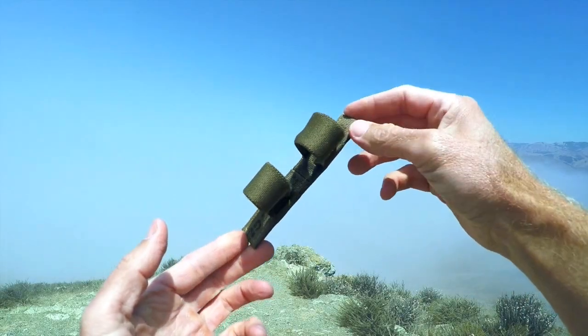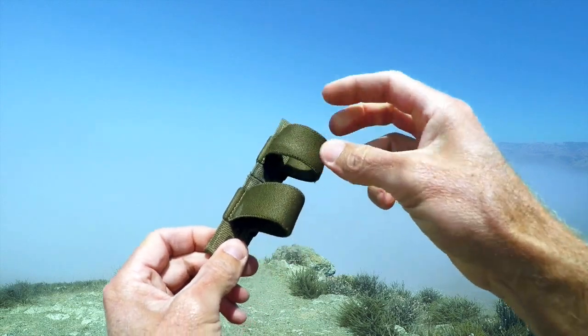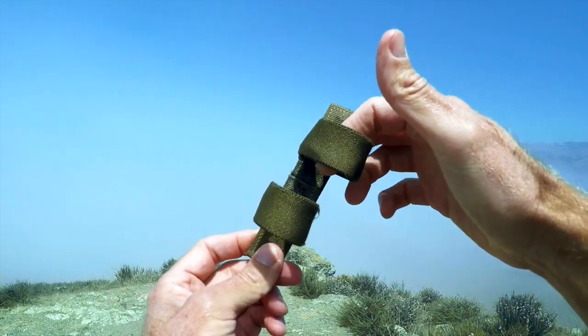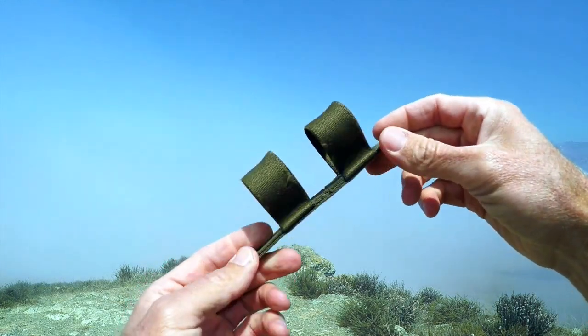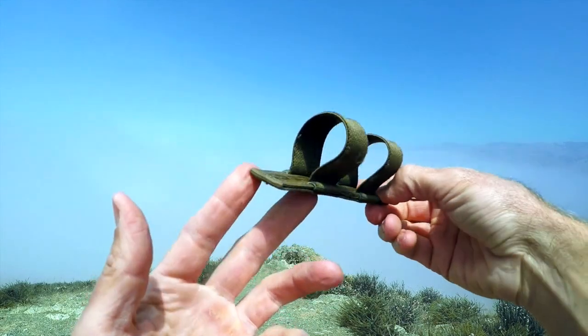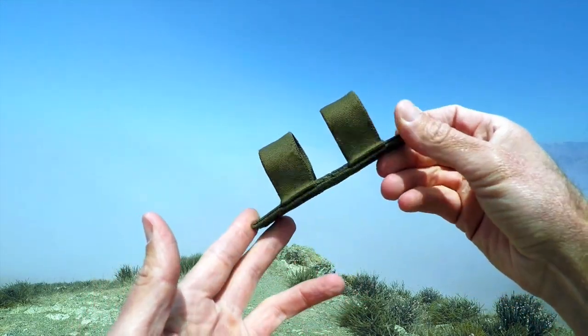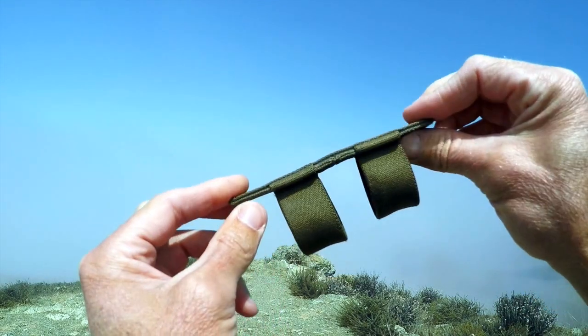The piece of kit is pretty straightforward. You have a semi-rigid piece, and off of that you have two heavy-duty elastic loops that allow you to put your tourniquet — either a CAT, a Soft-T Wide (which I prefer), or most anything else in there. You can fit flexi cuffs, a big log of summer sausage, whatever you want in there.